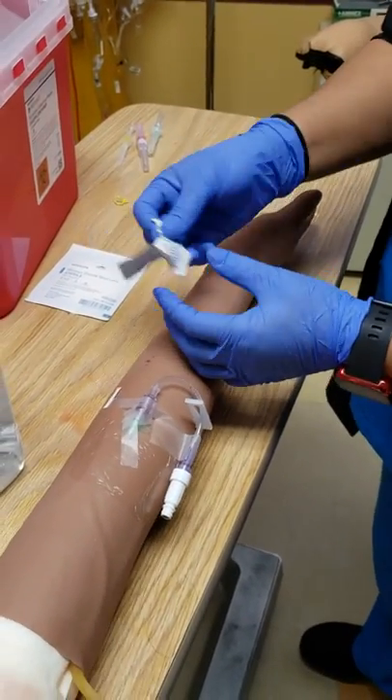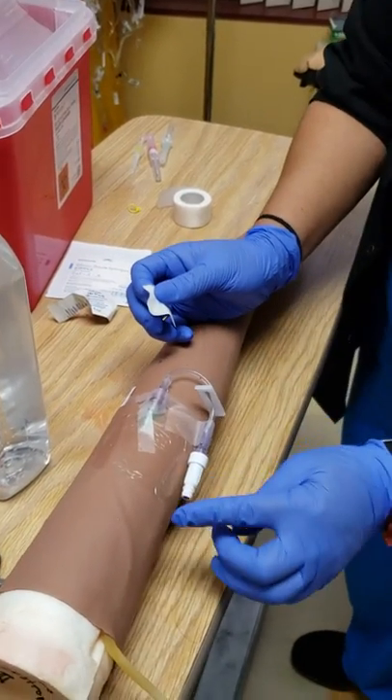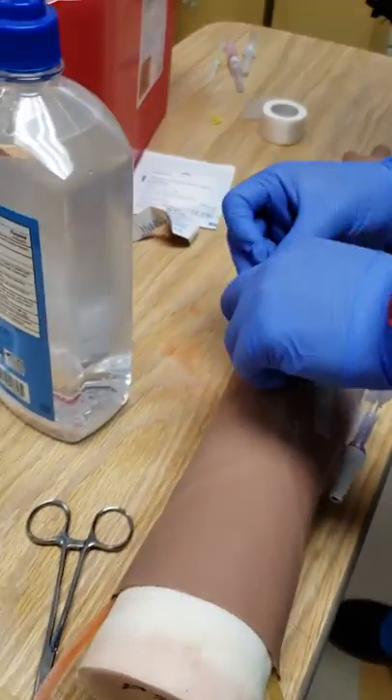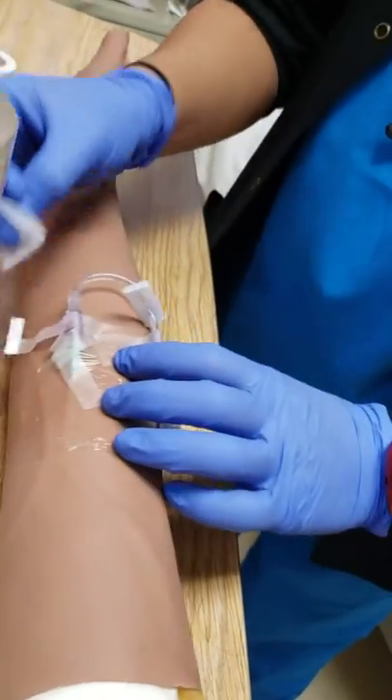To remove the IV you're going to need some alcohol pads — you might need a couple. The dressing is usually a little difficult to remove, so to avoid peeling off the patient's skin, you want to use your alcohol to gently peel it off.